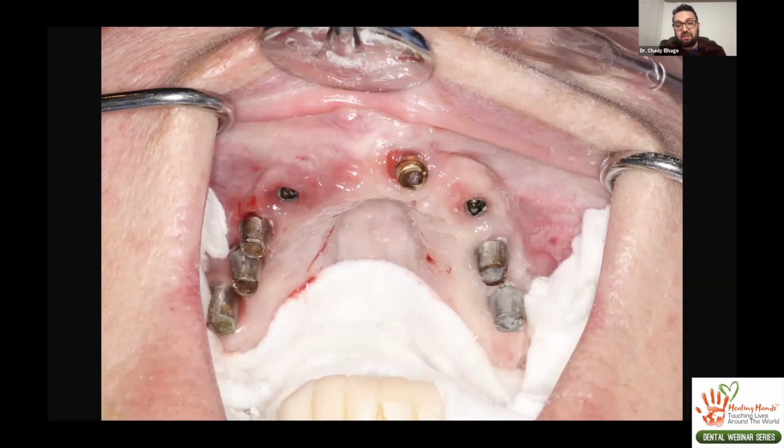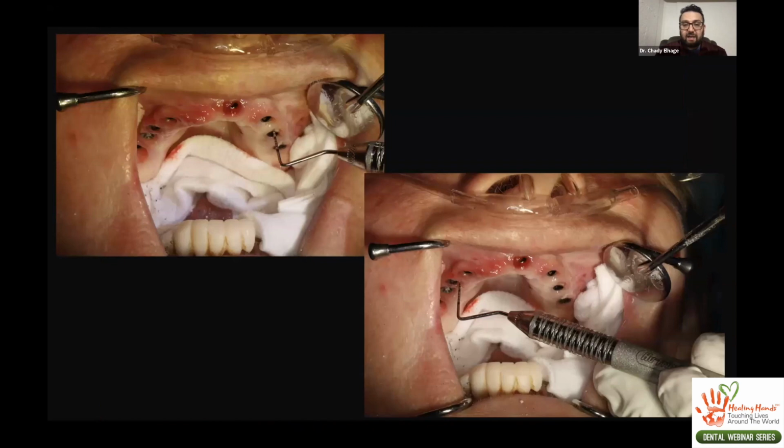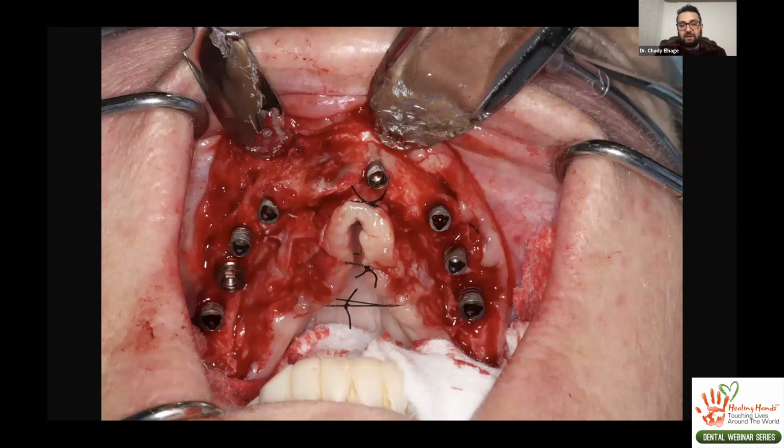Patient had a lot of food, a lot of debris in there. The pocketing around the implants was really not good. We had 7, 8, 9 millimeter pocketing. And so we get in there and we start cutting and taking apart. And you can see all of the implants just have bone loss. And so we said, you know what? It's just better that we take them out, start over, and start from scratch.